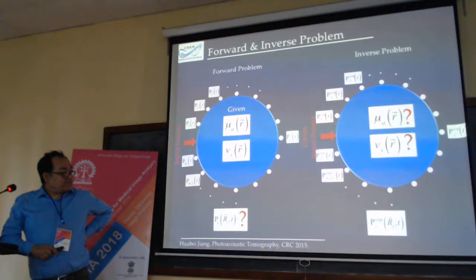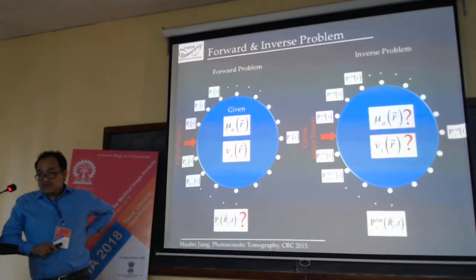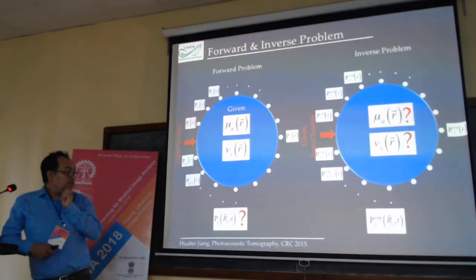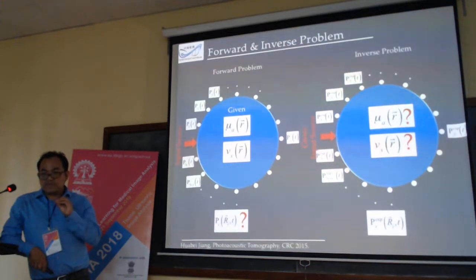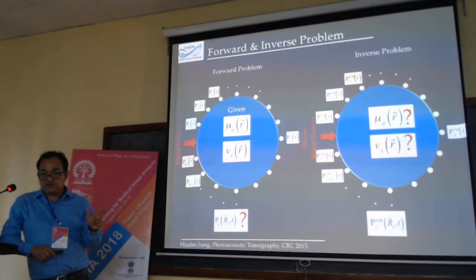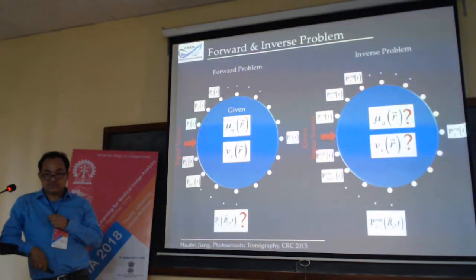From the experimental measurement we can get the measured signal by keeping an array of detectors, or a detector unit consisting of elements of detectors. The input intensity of the light we can also get from the experiment. Then whether the tissue is diseased or not, or at what stage, all these things we have to characterize from the distributions.